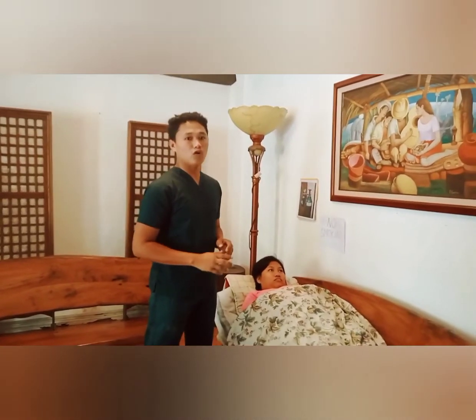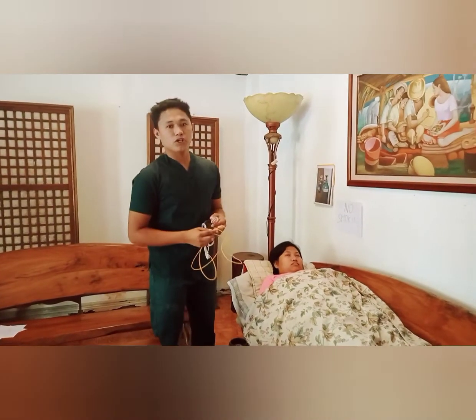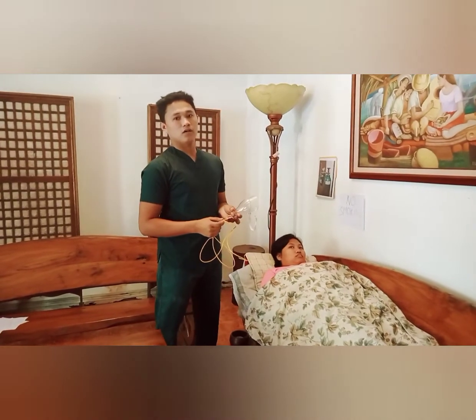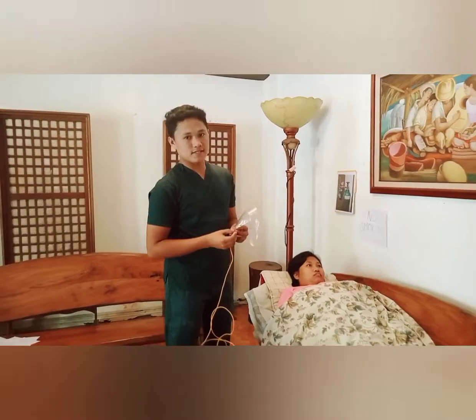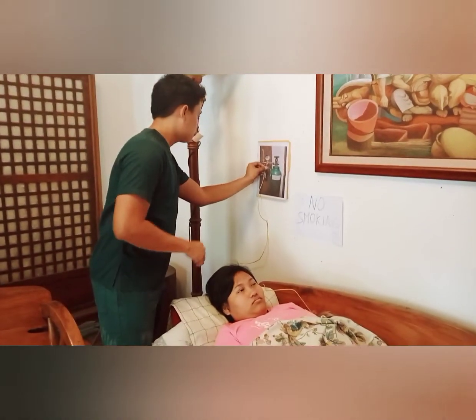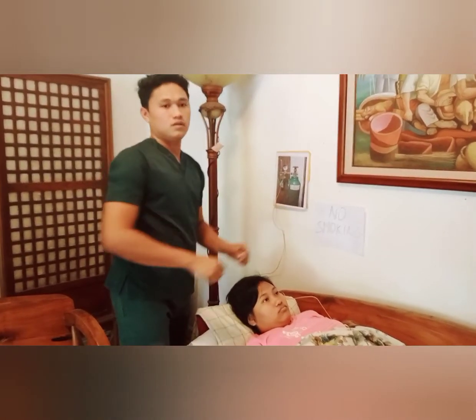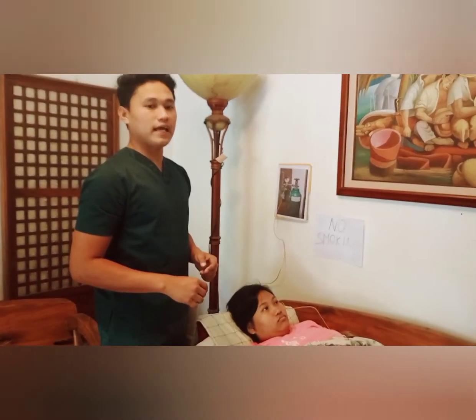Next, we are going to attach the humidifier to the outlet of the flow meter or regulator. And next, we are going to connect the tubing from the simple mask to the nipple outlet on the humidifier. This is improvised. Next, set the oxygen at the prescribed flow rate. The oxygen must be flowing before you apply the mask to the client.